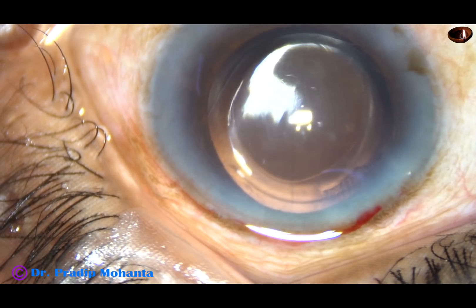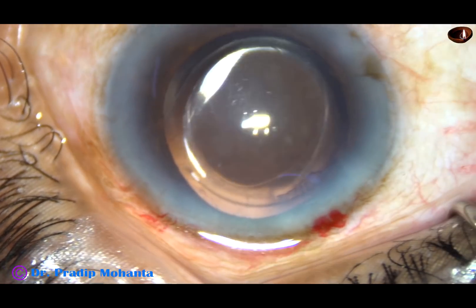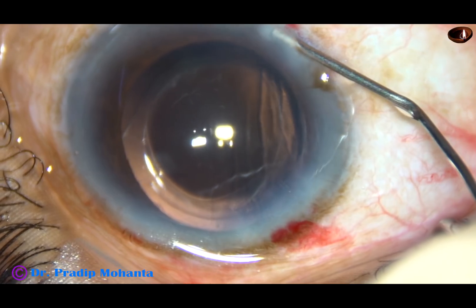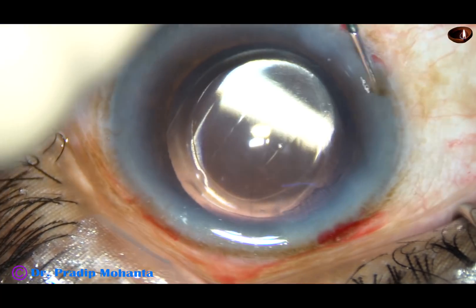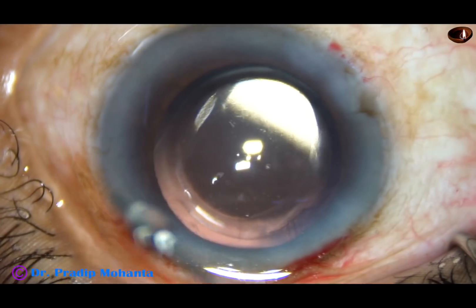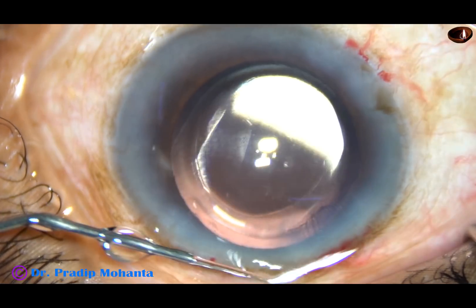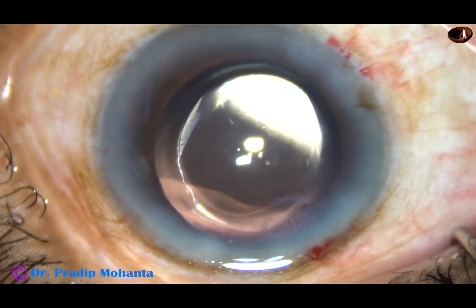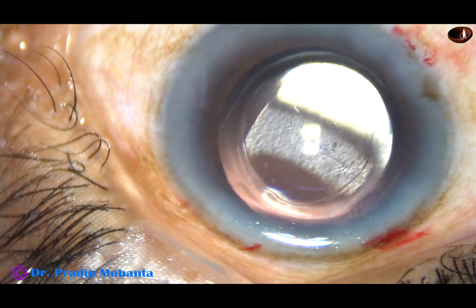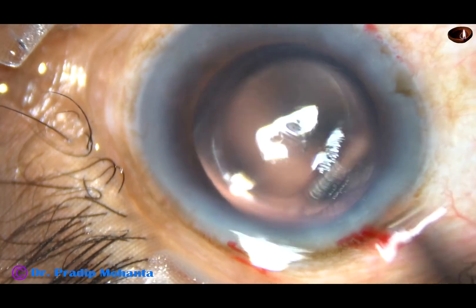Now the side ports are hydrated so that these stab wounds close. You must remember that if these side ports are very small, they get stressed and more hydration is required. If they are of medium size, hydration required is not much.